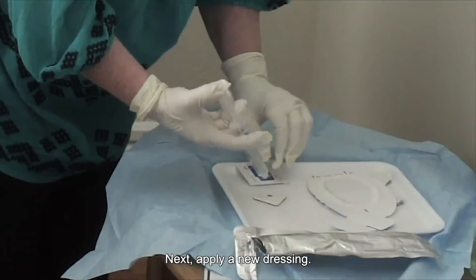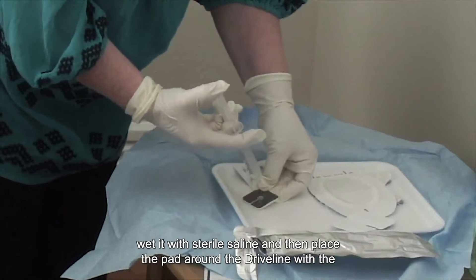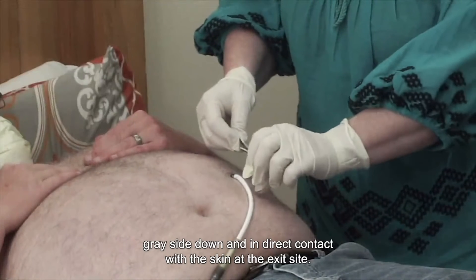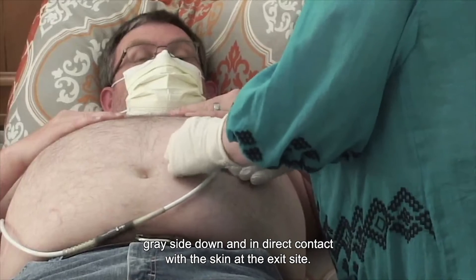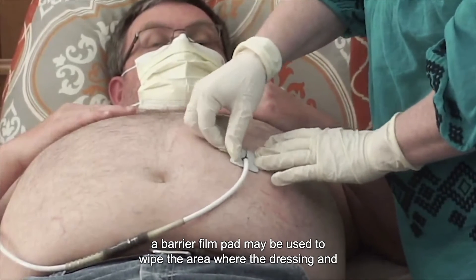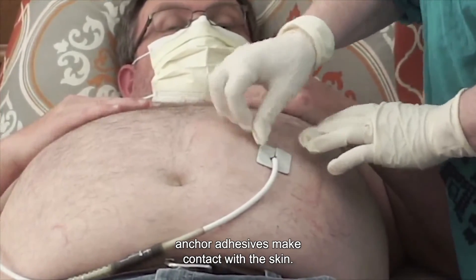Next, apply a new dressing. If using a silver pad, wet it with sterile saline and then place the pad around the driveline with the gray side down and in direct contact with the skin at the exit site. For patients with sensitive skin, a barrier film pad may be used to wipe the area where the dressing and anchor adhesives make contact with the skin.